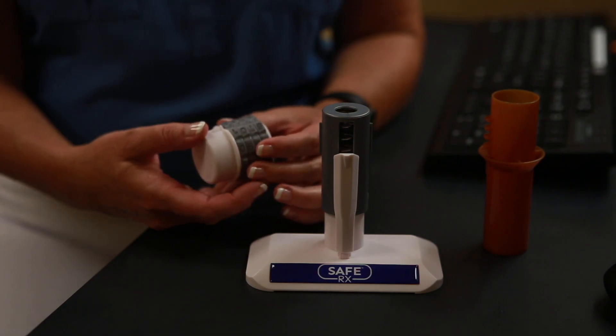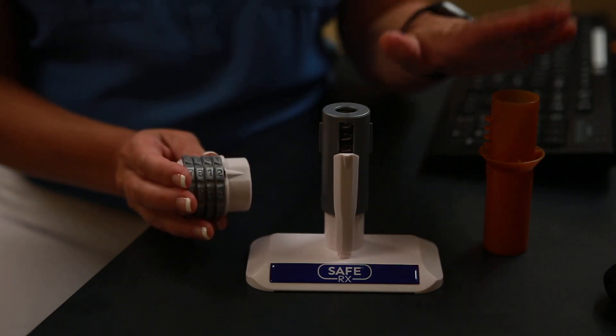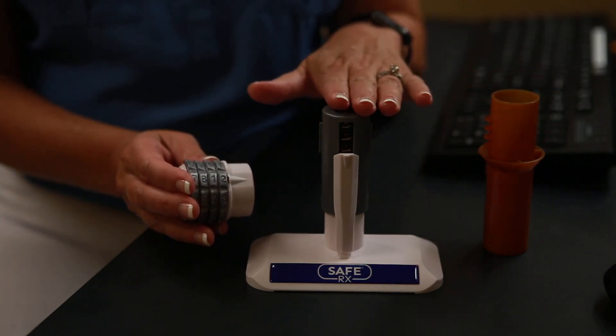The key is to know that there are three parts to this process: there is the cap, the vial, and the encoder.